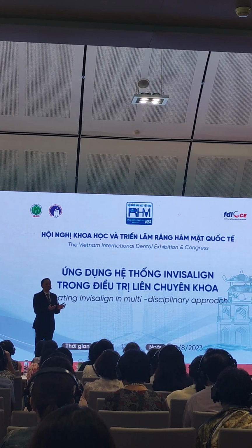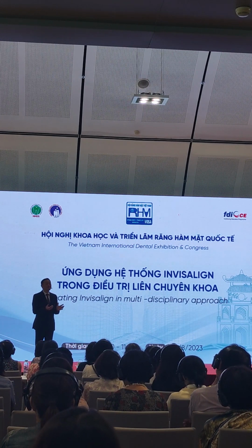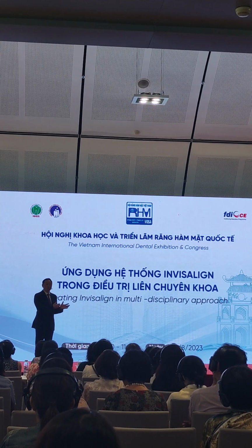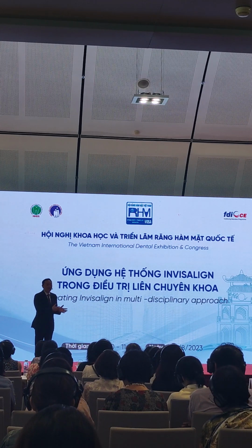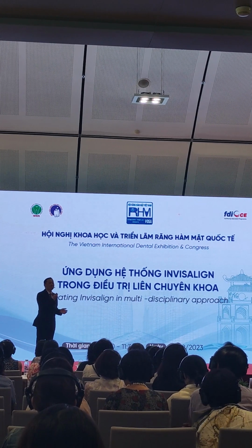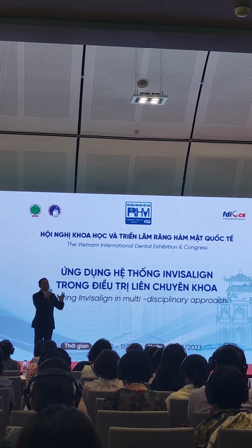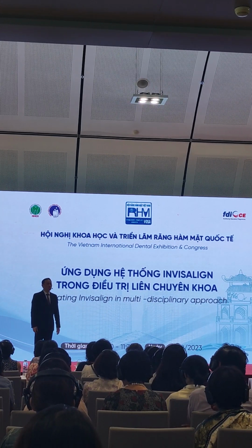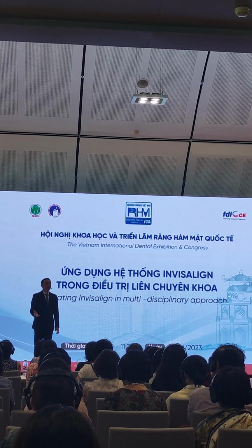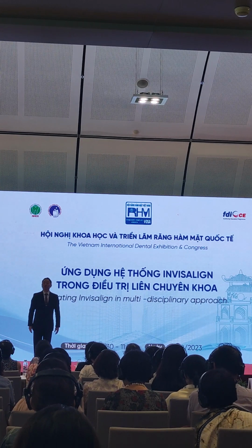How can I manage? Sometimes I do some occlusal adjustment. Sometimes I ask the patient to wear the aligner to eat. And sometimes if I think the root has a chance to come out, then I will use my ClinCheck to add some attachments, stop the treatment, and then rescan to move the root to the favorable position. That is why we manage if anything bad happens when we get too much premature contact.